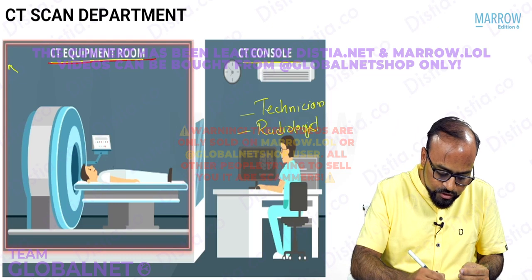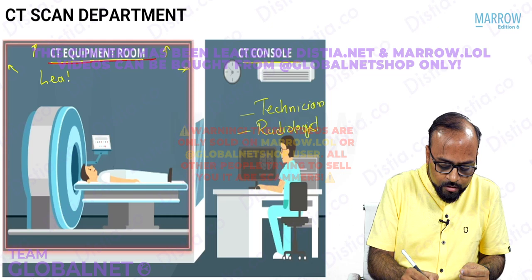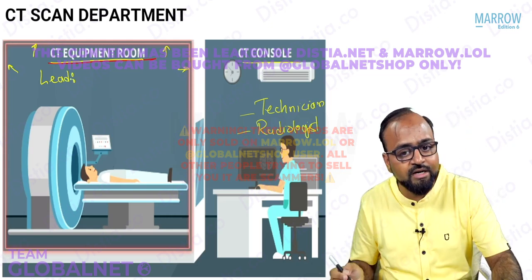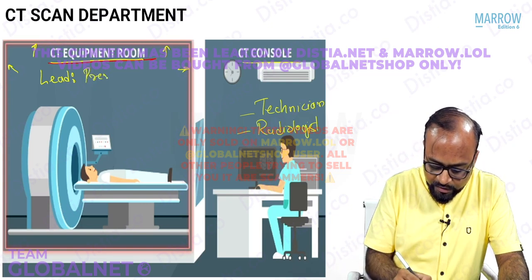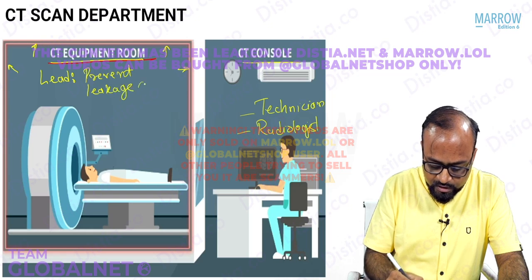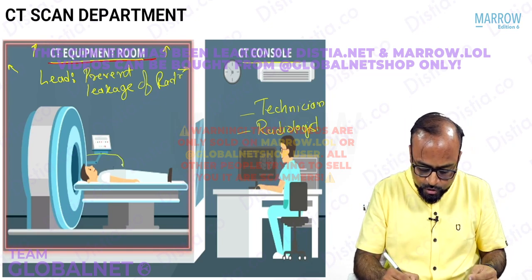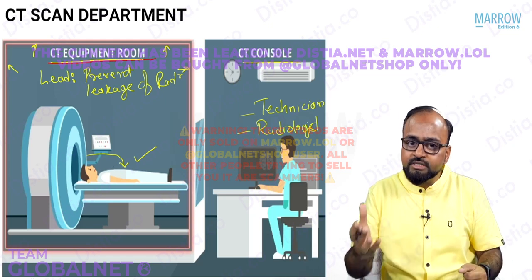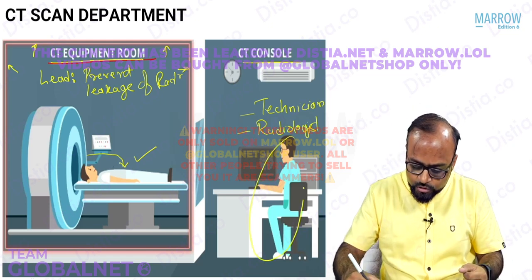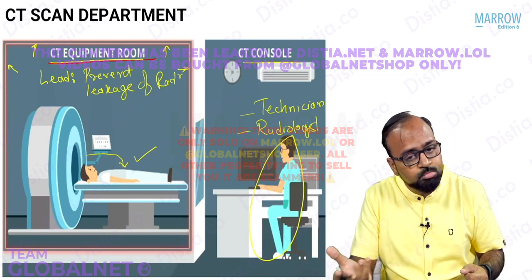Around the equipment room, in all the walls, everywhere around it, there is lead. Why is there lead? The purpose of putting up lead there is to prevent leakage of radiation, because CT scan has a lot of radiation exposure. That radiation exposure to the patient is justified because there is an indication to do the CT scan. Will it be justified if all the technicians and radiologists are also exposed? No. Will it be justified if the relatives waiting outside are exposed? No.